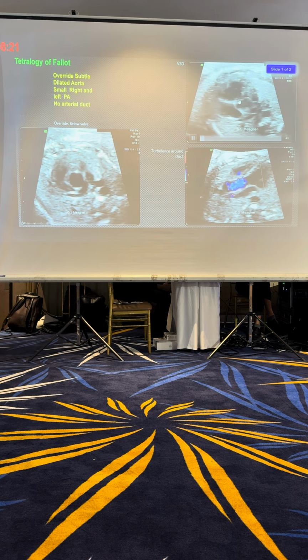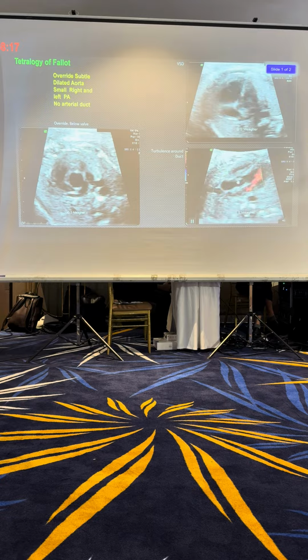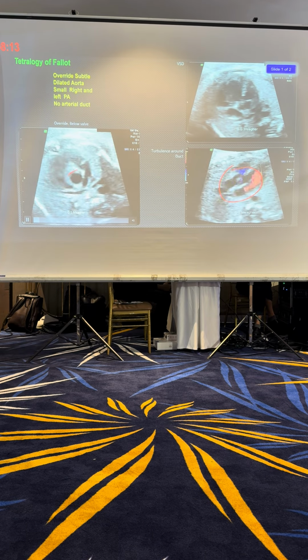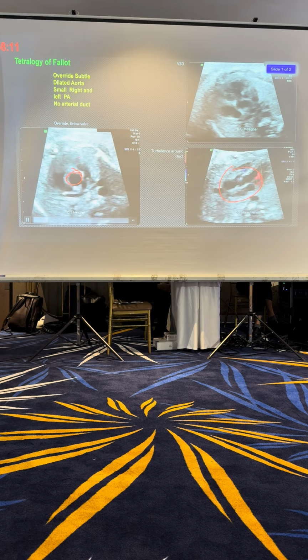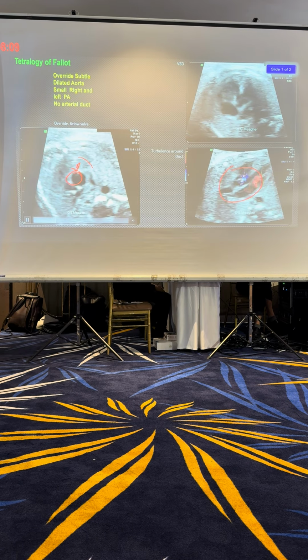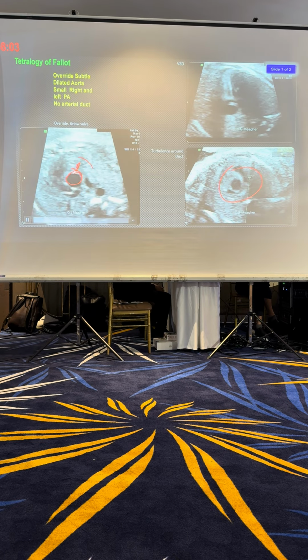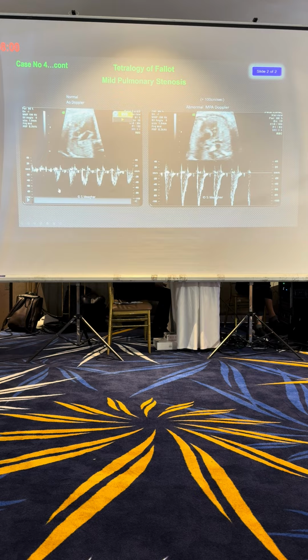Very quickly, this baby has got aortic override. This baby has got turbulent flow with the VSD, and the aorta now is bigger than the narrow pulmonary artery, and there's obstruction, infundibular obstruction. That baby has got an obvious tetralogy of Fallot with mild pulmonary stenosis. How do I know?